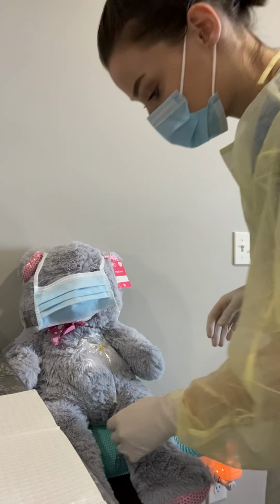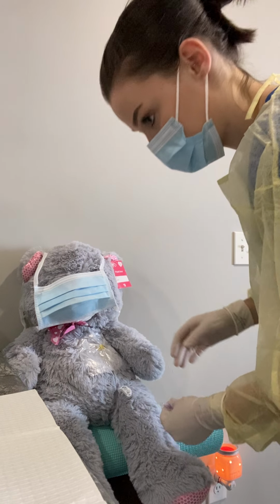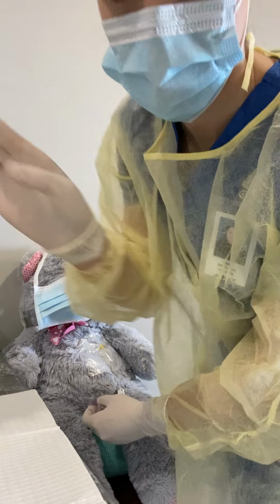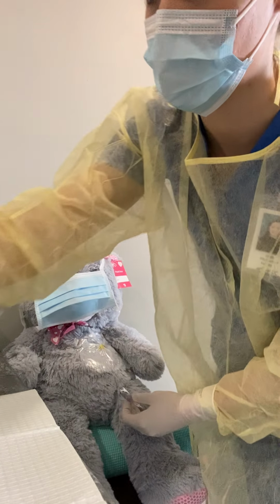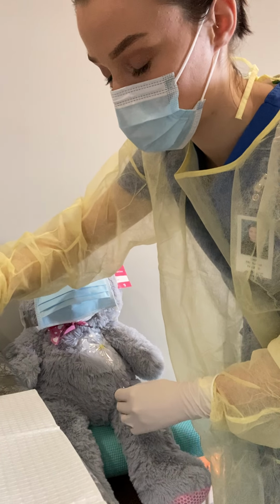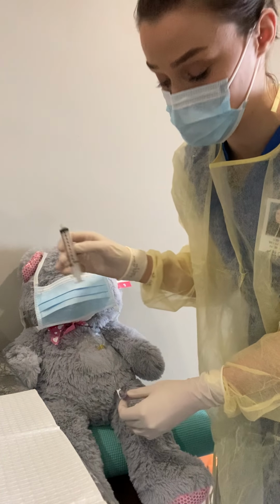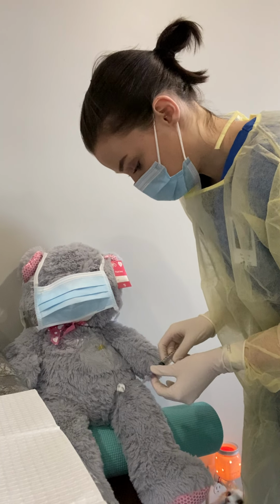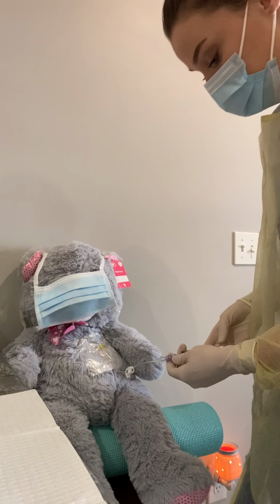So first, I'm going to go ahead and scrub my hub. So I've got my alcohol pads, and I'm going to open that and scrub the hub. And then I'm going to get my 10 milliliter syringe and attach that. And I'm going to pull back.